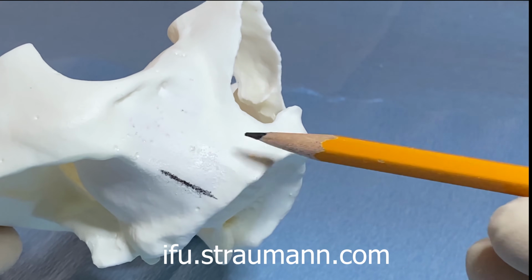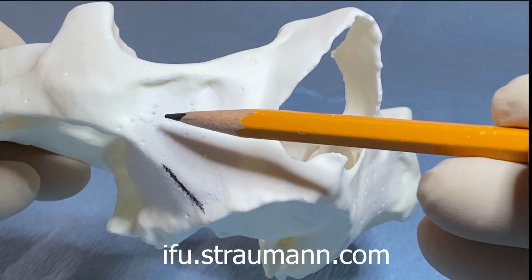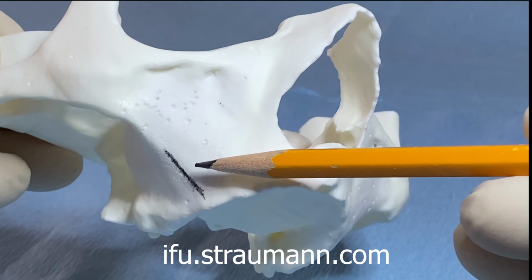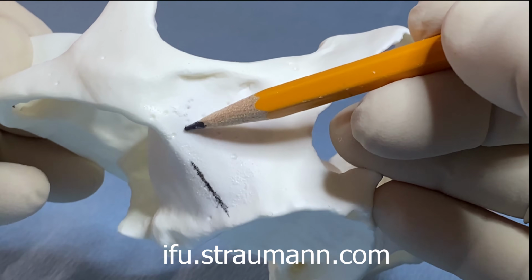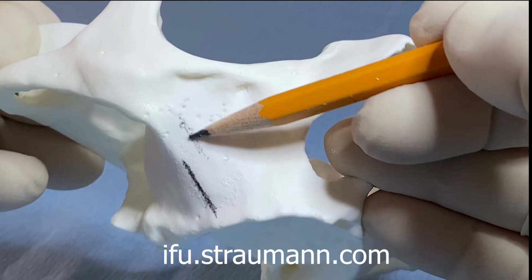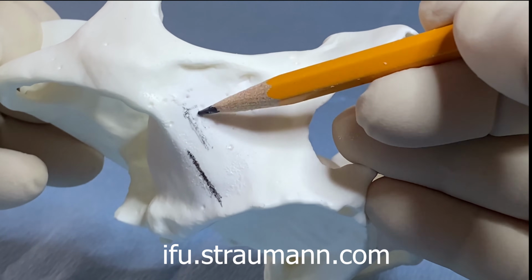So there's the black dotted line. The lateral maxillary wall becomes the posterior maxillary wall. That's our corner. The reason why this is important is when we make our window, the lateral window, we want to parallel the posterior wall of the lateral window with our black dotted line. So in order to do that, we can use burrs to make small dots, or we can use a surgical pen or pencil to actually make the posterior wall, as you can see, parallel to the black dotted line, and then maybe a couple of millimeters wide.